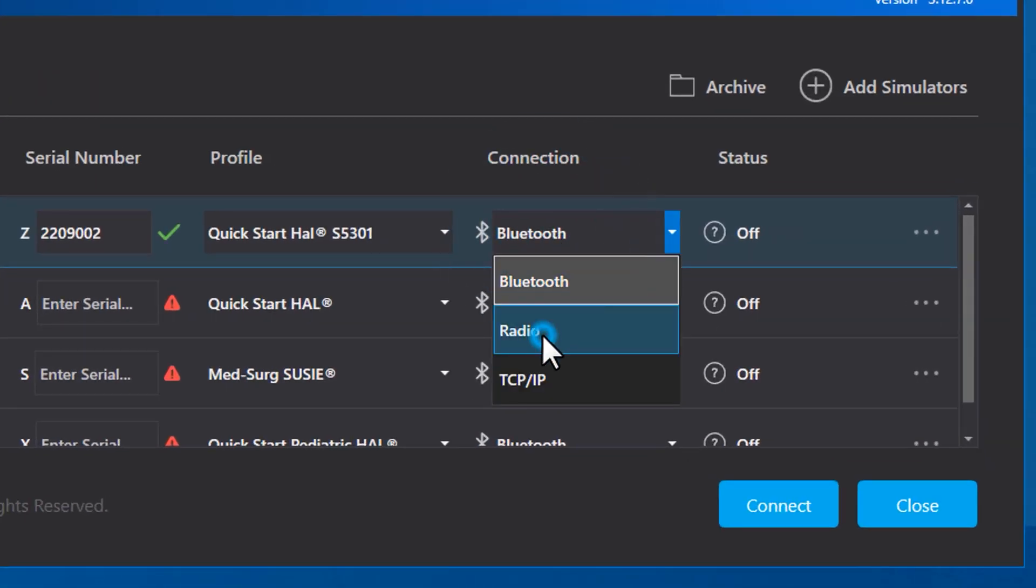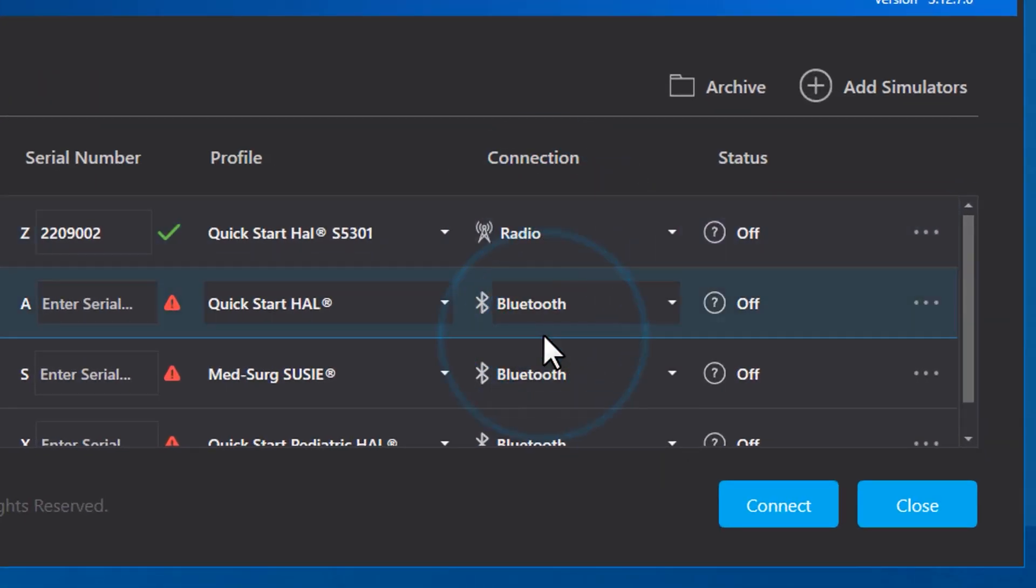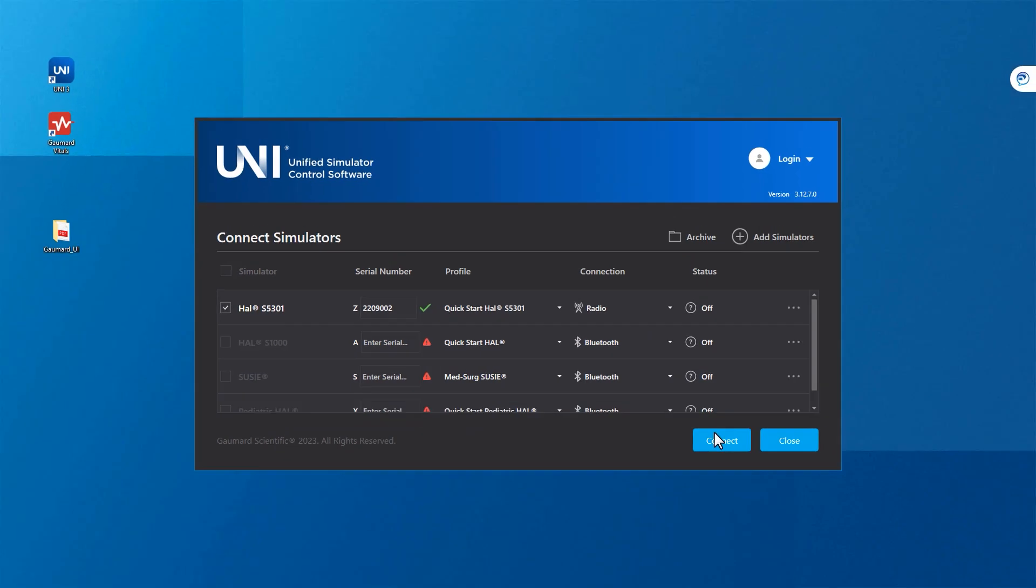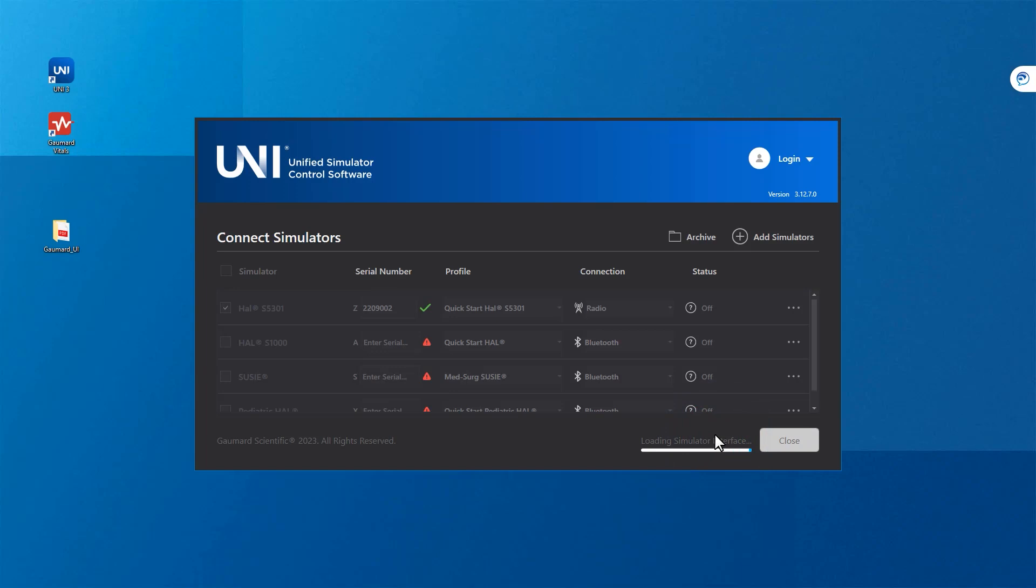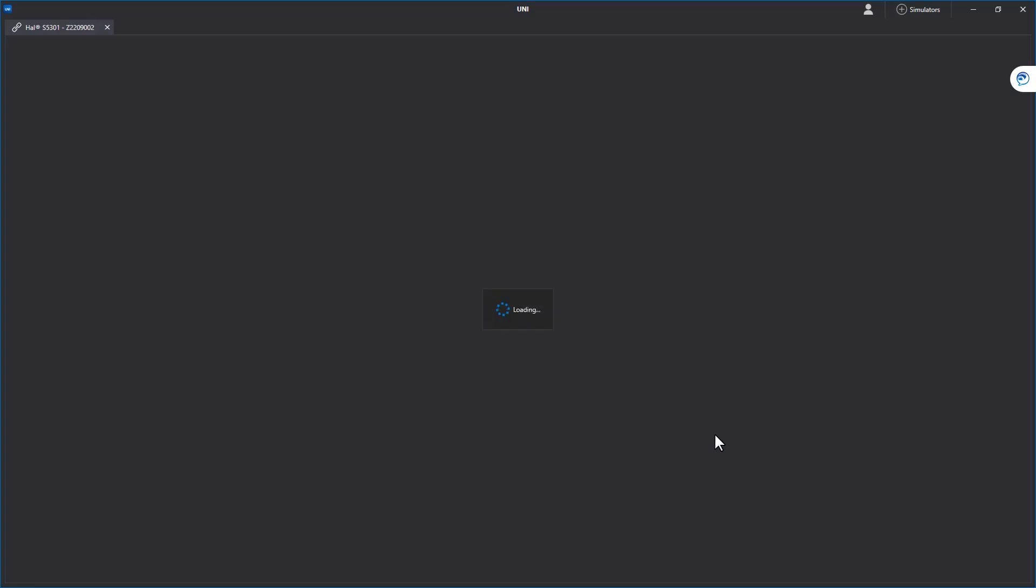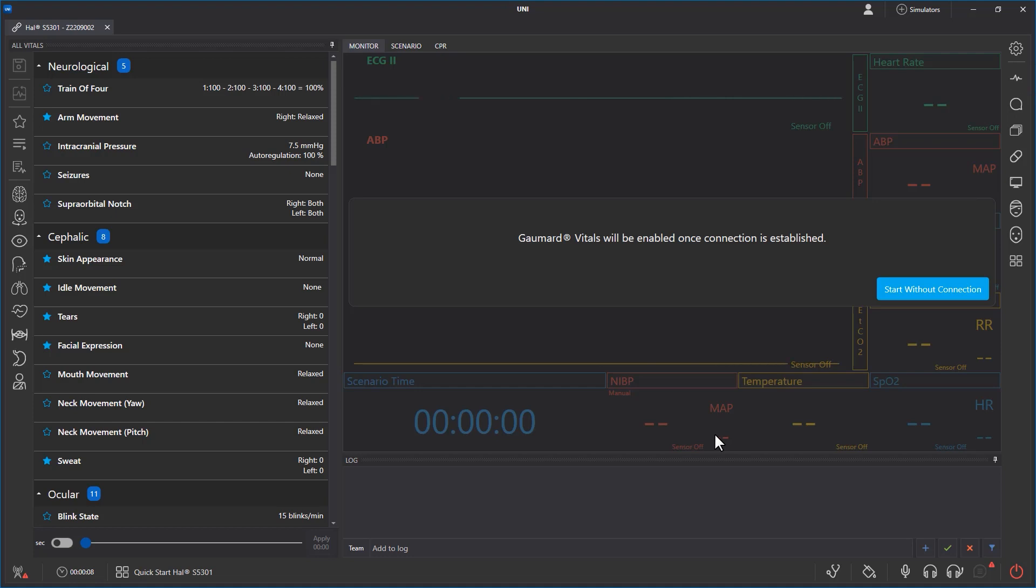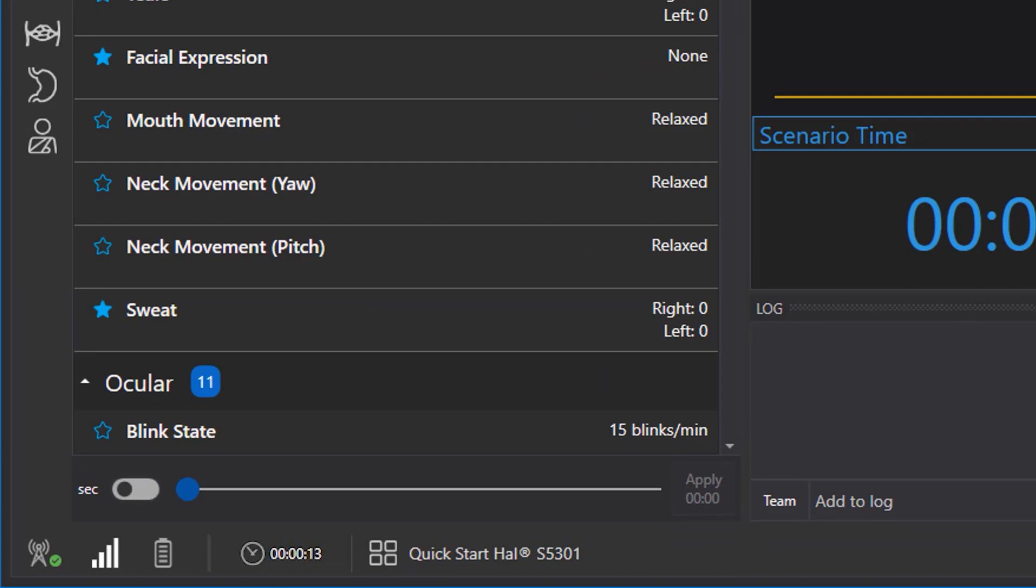Change the connection type to Radio and click the Connect button to start the process. Establishing a connection via RF can take a few moments. When successfully connected, the icon in the bottom left will show the strength of your connection.